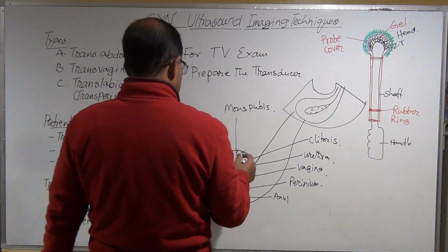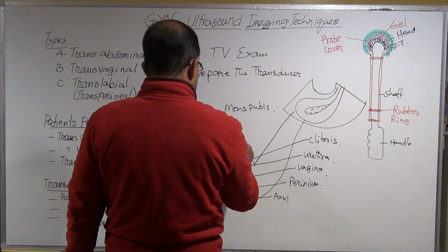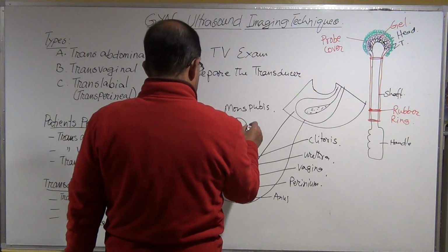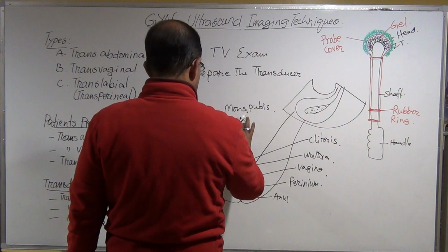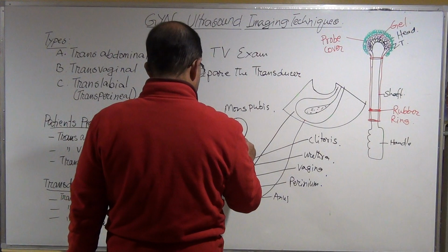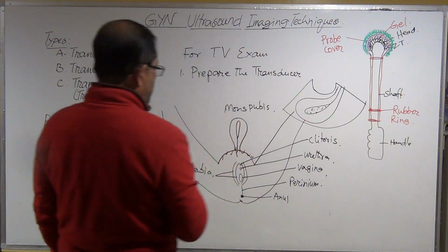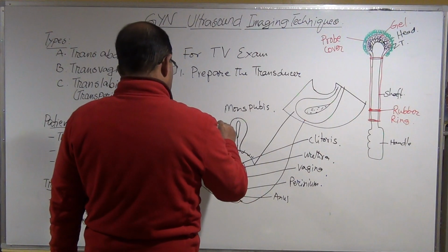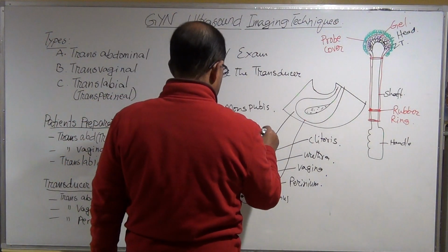Just understand that the uterus is here. The ovary is here in the pelvic cavity.